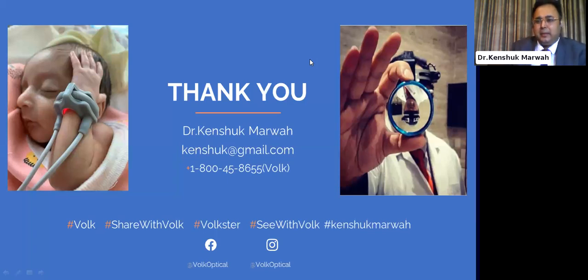In our practice, Dr. Shashank Patel, who was our professor, used to tell us to always hand over a lens held by the lens rim, not on the lens surface. Sometimes an assistant in your clinic gives you the lens from the case and touches the lens surface. That is the first mistake.